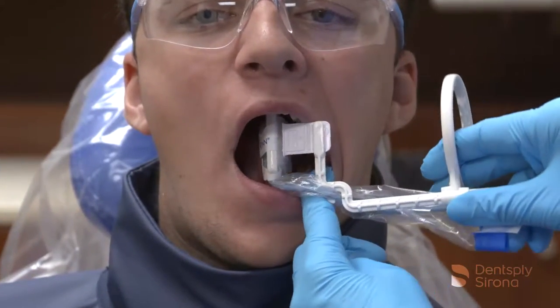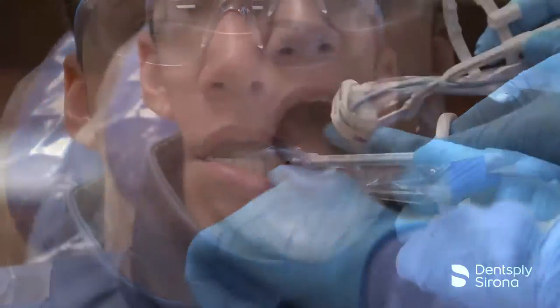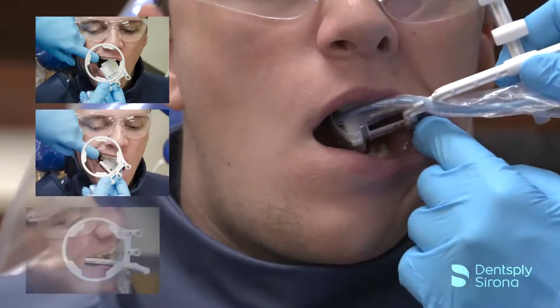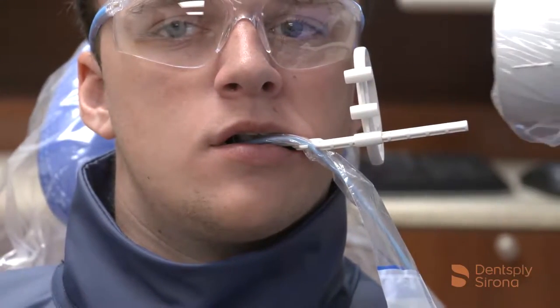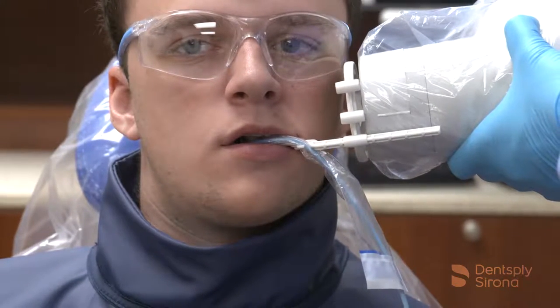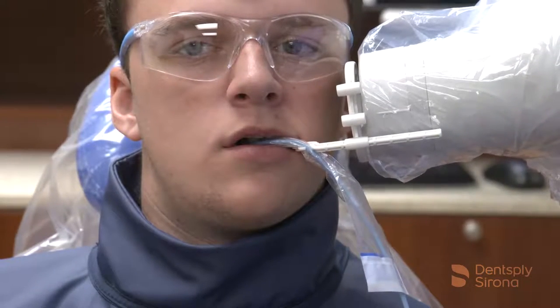Place the holder in the center of the patient's mouth to maximize patient comfort during the procedure. If the patient has a shallow palate, use a cotton roll under the bite piece to aid in patient comfort. Once the bite block is in place, slide the aiming ring down the arm close to the patient's face. Align the tube head of the x-ray unit in a close approximation to the aiming ring and center it. The x-ray image is now ready to be captured.